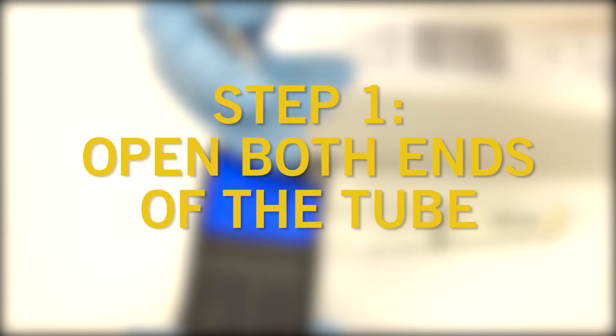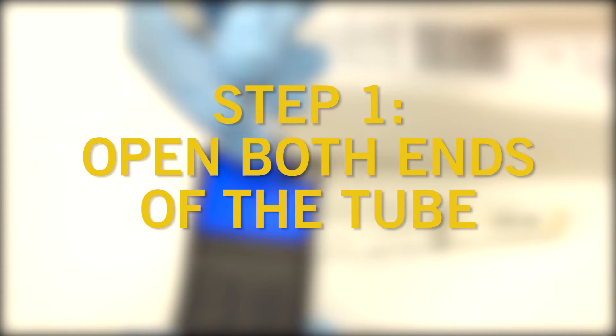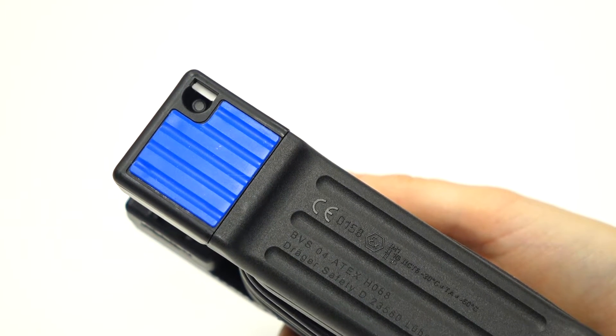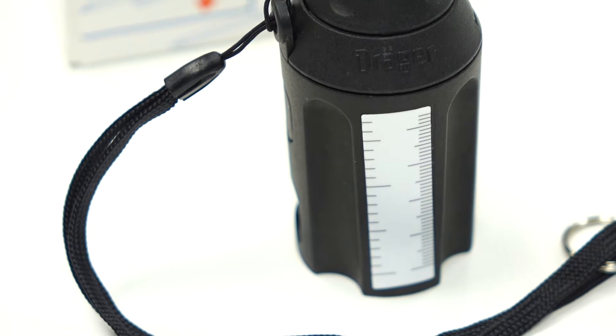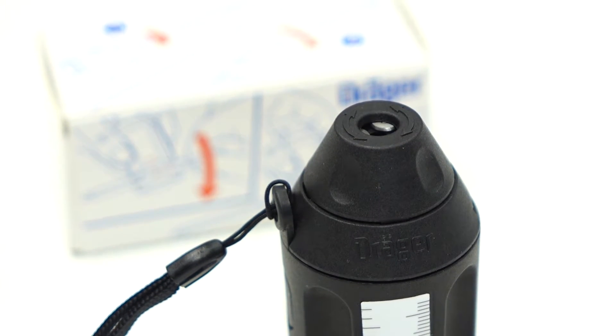Step one. The first step is to open both ends of your Draeger tube. This can be done in two ways: use the integrated ceramic blade on the bottom of your Acuro, or use the deluxe tube opener. In this case, we are going to use the integrated blade.